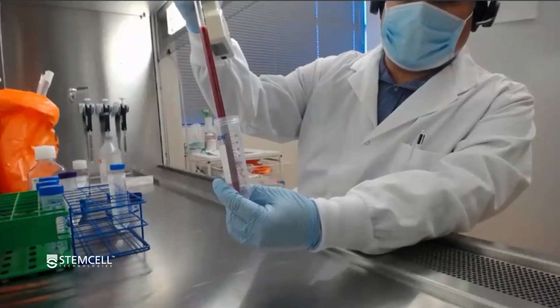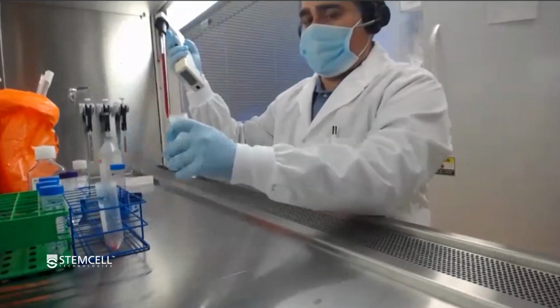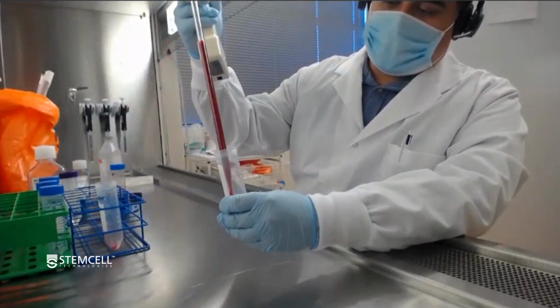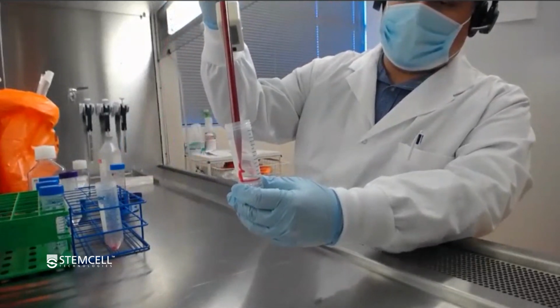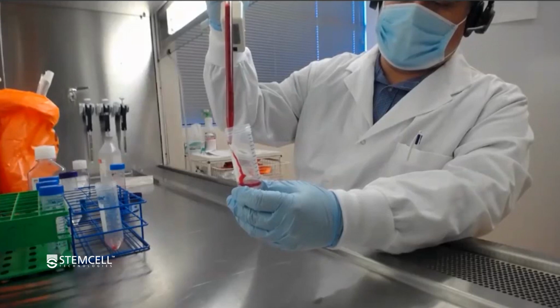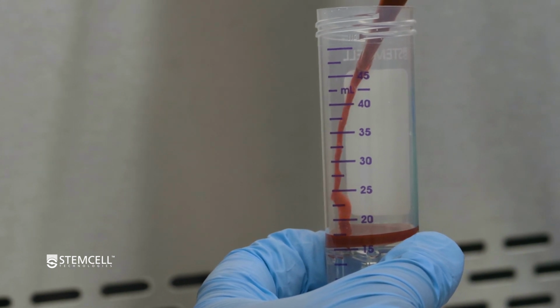Okay, so here I'm just going to dispense this whole 10 mil diluted volume into the SepMate tube, which has been prepared. And I like to just place the tip here and then in the beginning, you can try doing a slow dispense, but it really shouldn't make too much of a difference. You can see that this is certainly a lot faster than having to do a traditional Ficoll non-SepMate layer.